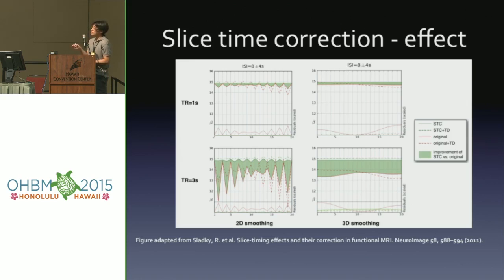So you can see in all cases, when you do slice timing correction, you have clear improvement. And the longer the TR you have, the more correction you will end up with. Also, if you look at the residue, you can see the same thing: the residue decreases when you use slice timing correction. And when you have longer TRs, the reduction in residue is larger.